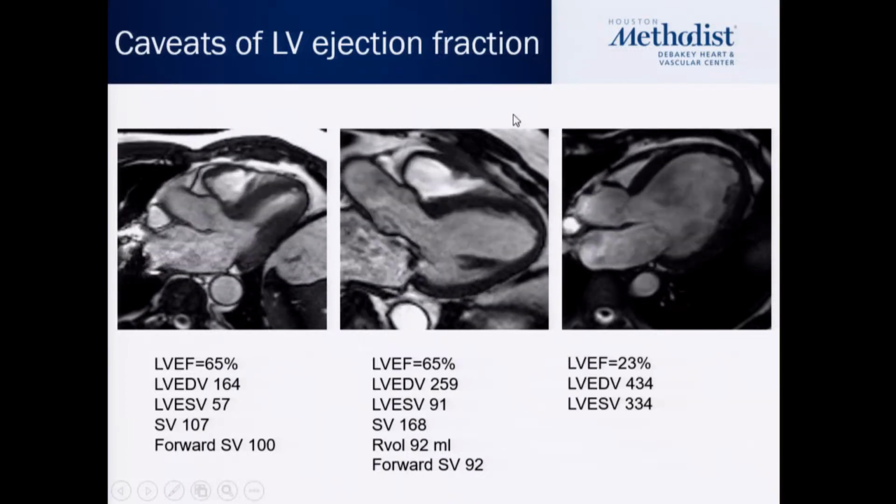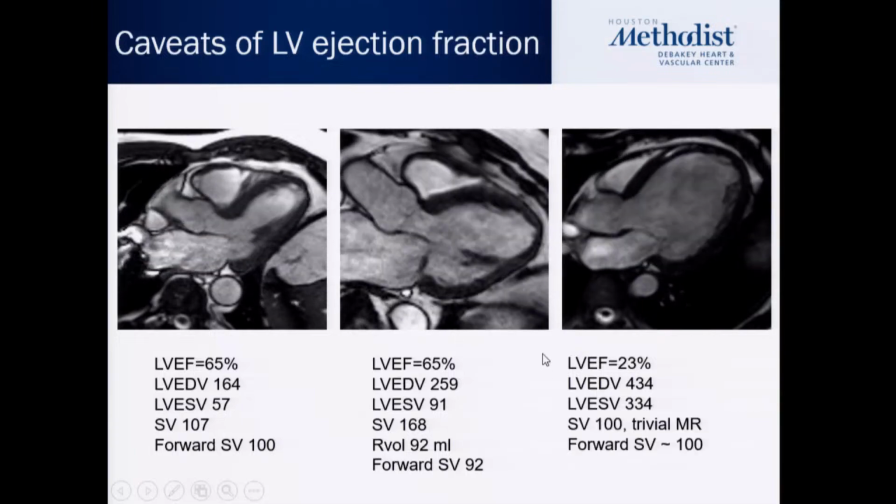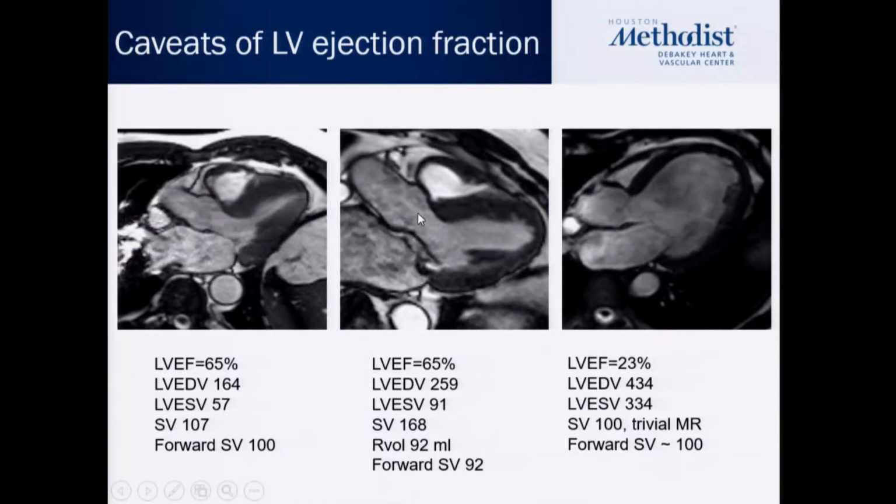This patient has severe heart failure, EF 23%, a very large ventricle, but he actually is able to achieve a similar stroke volume to those two.